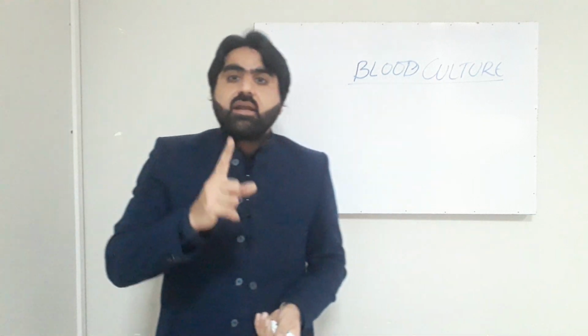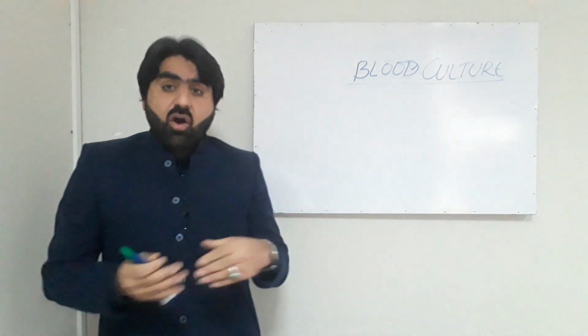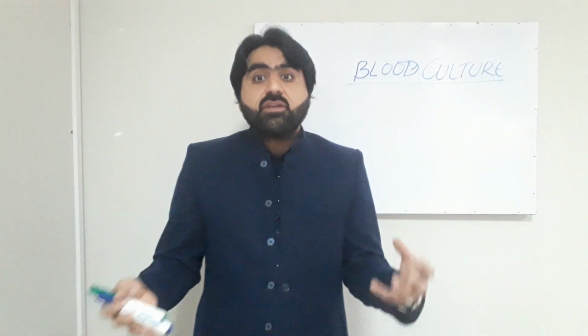So one blood culture set is composed of 2 bottles of blood culture.